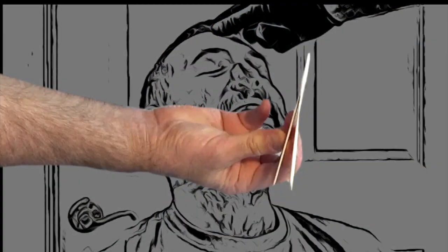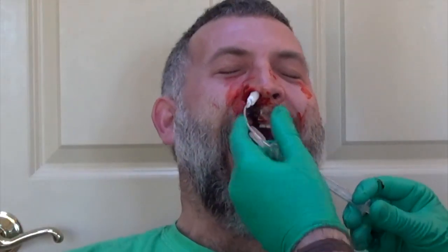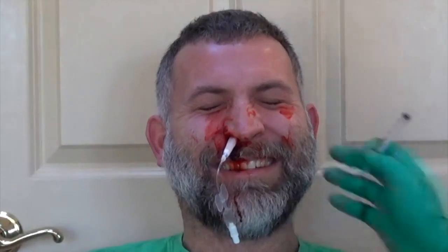This is a much more comfortable form of nasal packing. Remember that the super painful packing products are still an option if this doesn't work. Try to be kind.